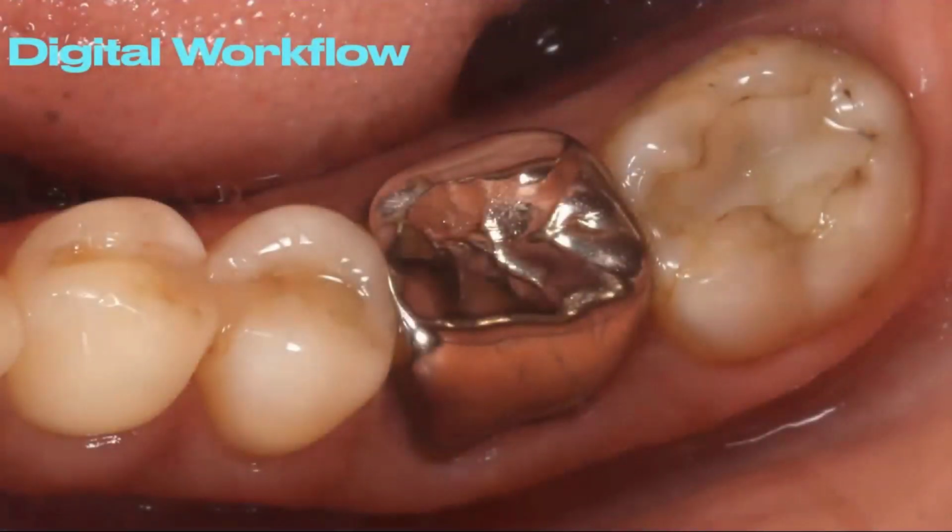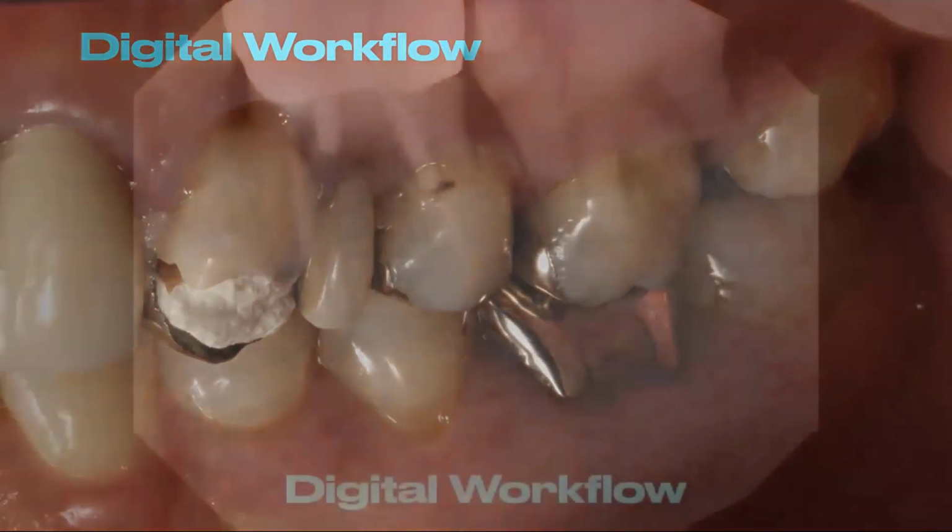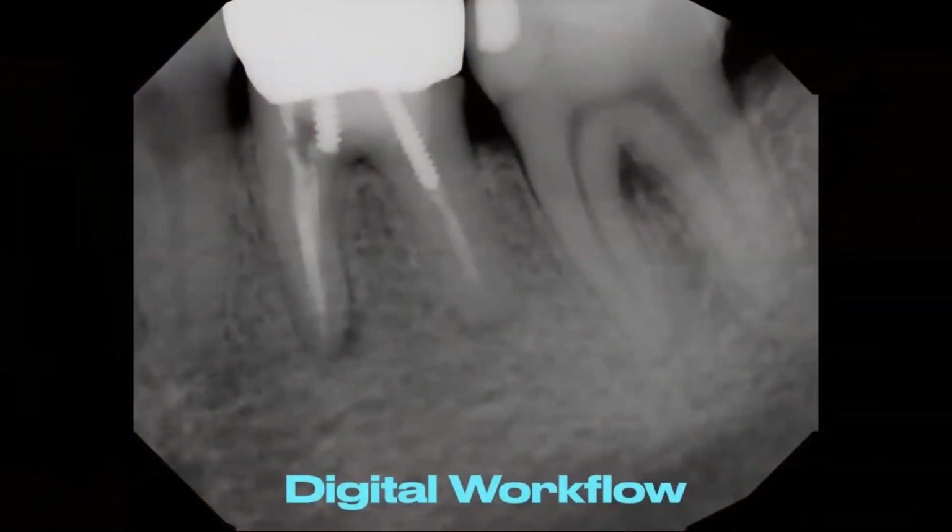So let's look at this for something simple, like a single molar. We use the technology for us to look at this case, and we can take a look at a single molar and say, gosh, we've got to do some work. You can also see there's some work that needs to be done on that premolar as well. And we'll get there, don't worry. We look at the workflow and say this tooth is not doing well. The CBCT indicates a root fracture, which would be hard for you to diagnose on this two-dimensional image.